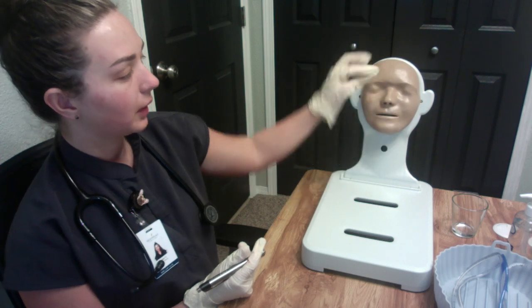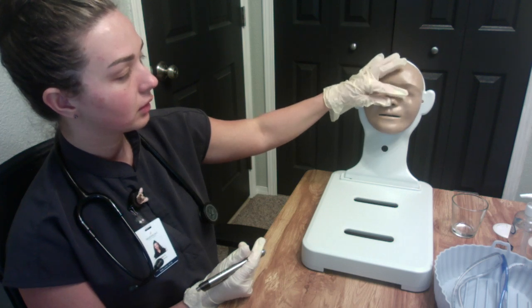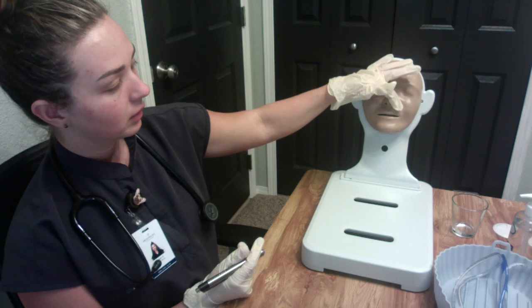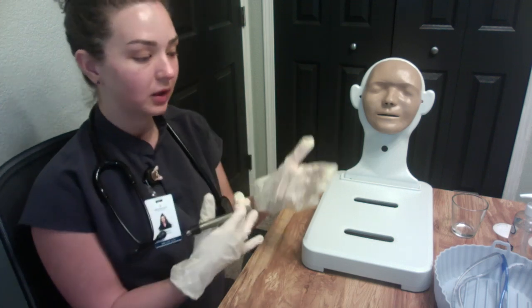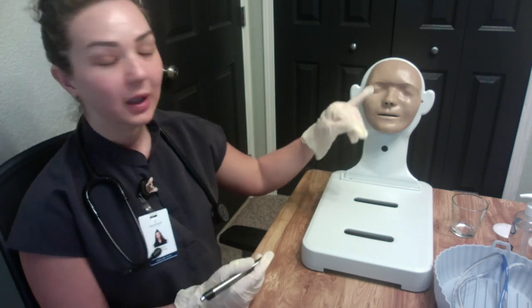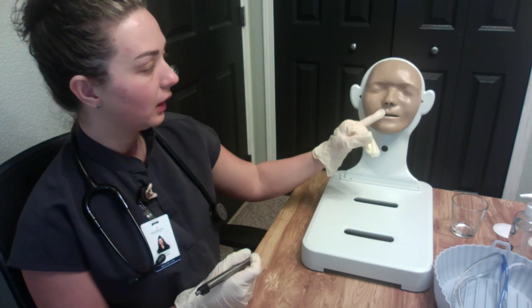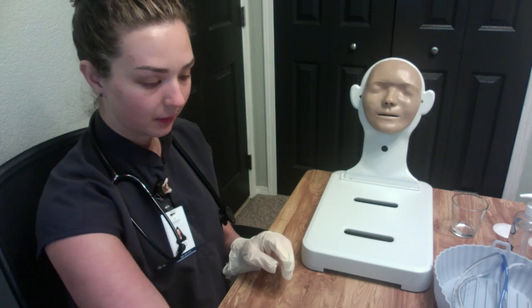So we would plug one side of the nose and have the patient breathe out, so we could then determine which nostril has the most flow. Okay, so it looks like the right nostril has the most flow, so we're going to go ahead and use that side. Pen light.